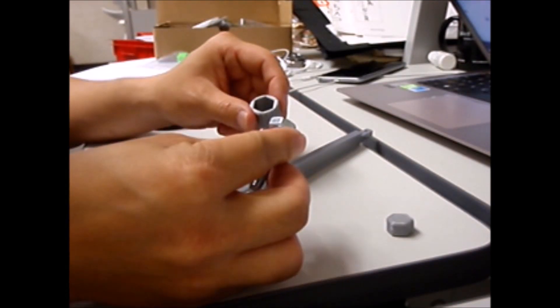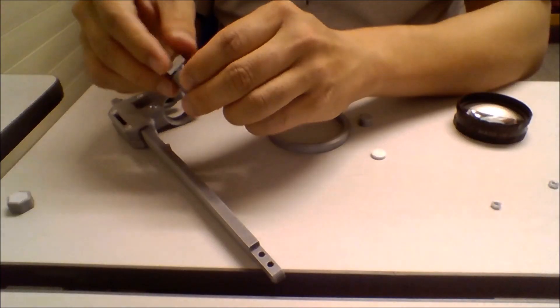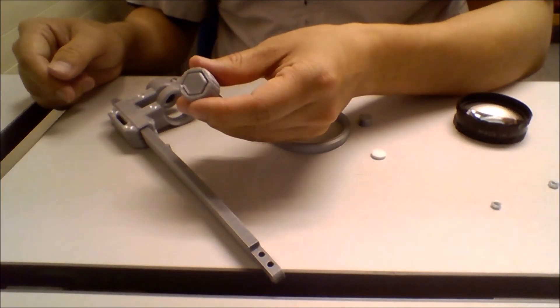Place the M8 bolt into the bolt cap and cover it with a cap insert. You'll need to glue this part together.